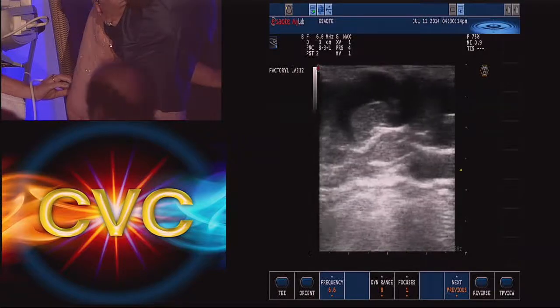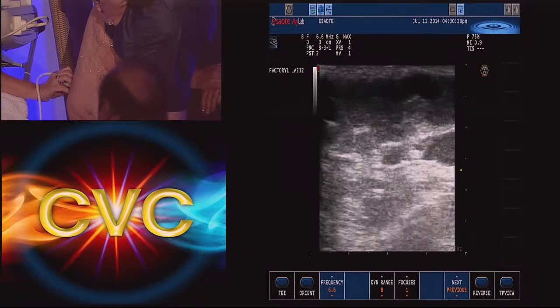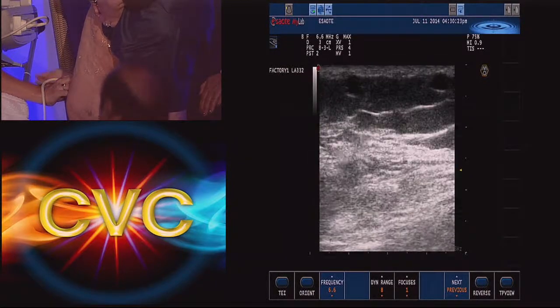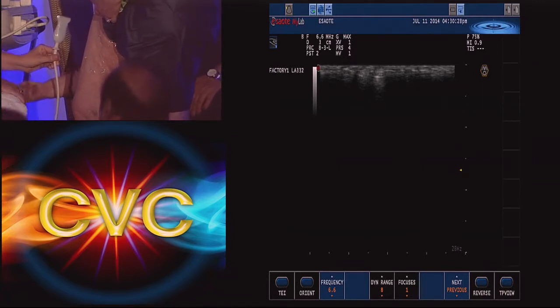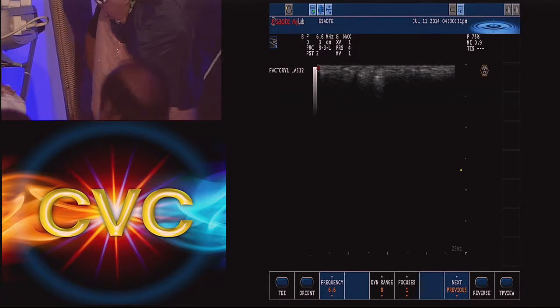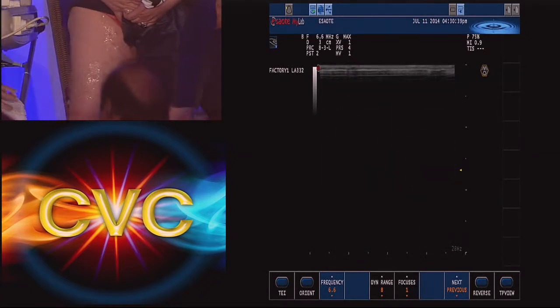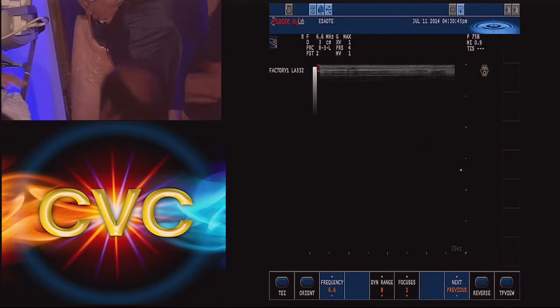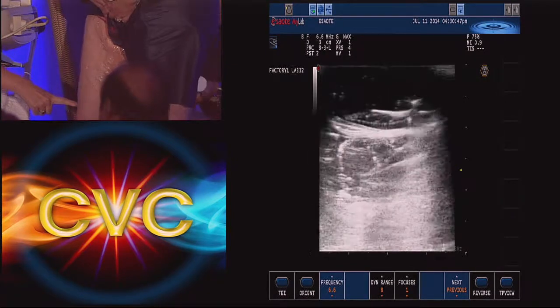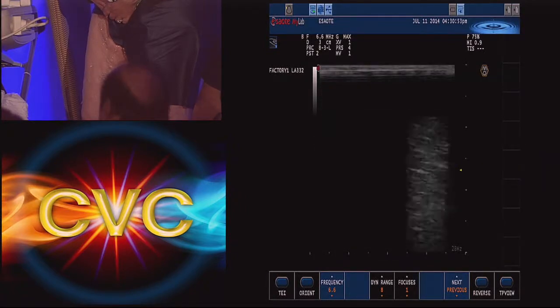Once you close that short segment, how is the venous return? The venous return from below, they're perforators. They're going into the deep. We have countless perforators, some named, some unnamed. So you close the segment, and it goes up into the common, because there's a very short segment. You don't want to shut the common femoral. Yeah, till whatever is abnormal. Because in this case, you see it's all popping out right here. So in her case, you're just doing a very short segment right there. Now, if you treat all this, it means nothing.